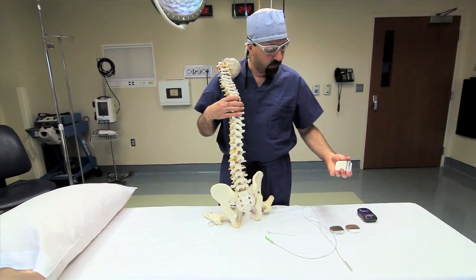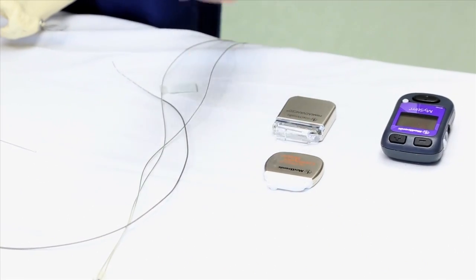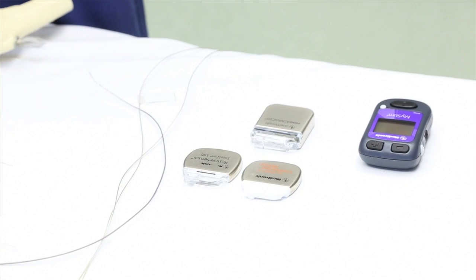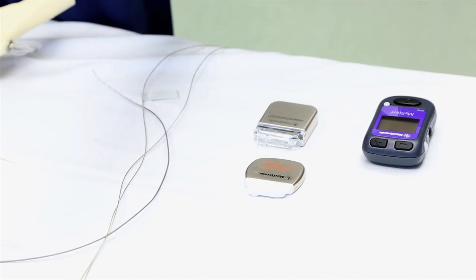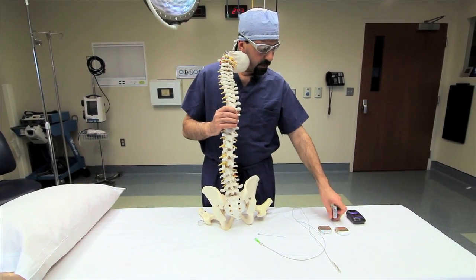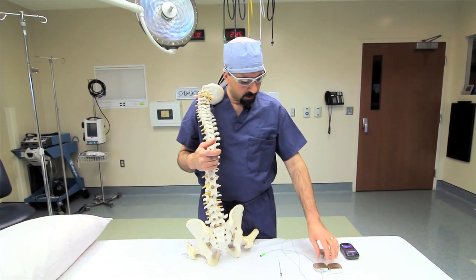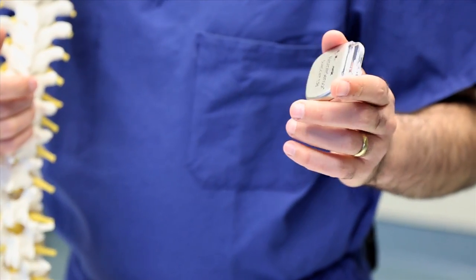There are two different batteries. One is a rechargeable battery, and they have Restore or Sensor One, and they have a newer one which is Ultra, and it's much thinner than this one and slightly smaller, so it doesn't bother the patient. For patients that don't want to bother with recharging the battery, we use a non-rechargeable battery which lasts for 6 years, and the rechargeable battery lasts for 9 years.